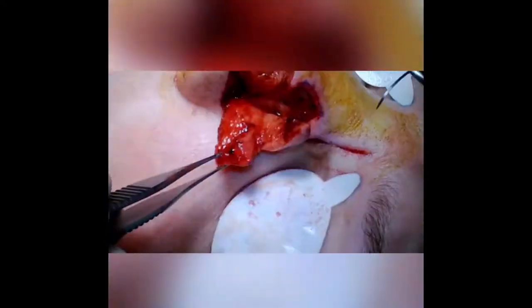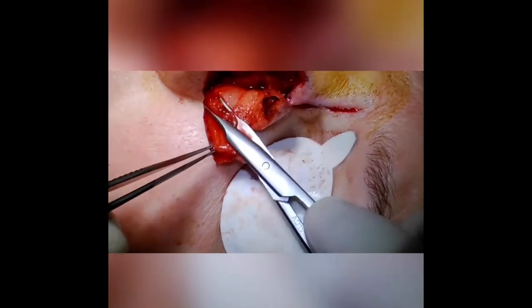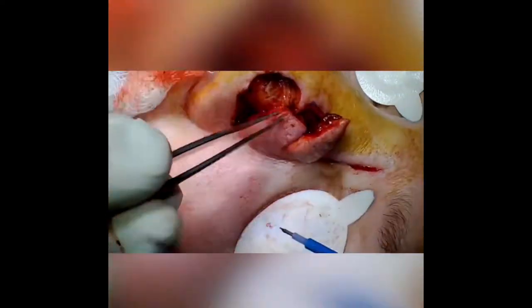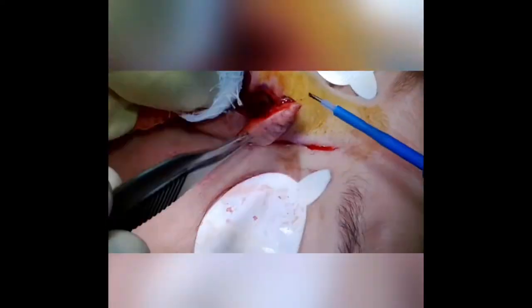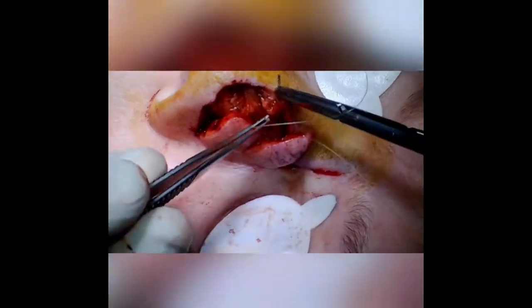Then I'll set the first lobe by first trimming a little bit of excess thickness of the flap. I eyeball the thickness and lay it into the defect, trying to get the depth to match the thickness of the flap.